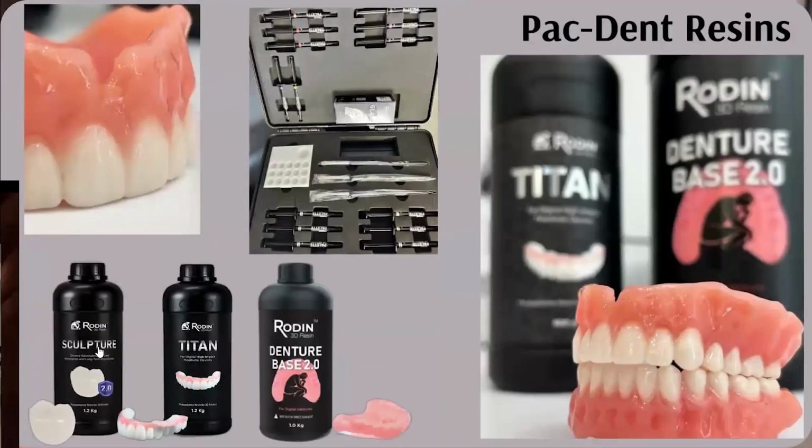Shoot, it's great. I've been watching denture bases all along, and up until recently, the Lucitone product was kind of a standalone thing as far as strength and aesthetics, but that's changing. And I told this several years ago that other people are going to catch up. And this denture here, this set you see here, I just printed recently out of their new denture base 2.0. And for the teeth, I used their Titan for this case, just to see how it would work for a denture tooth, more used for a fixed or maybe an implant case because it's so strong. But God, I'm thrilled. This stuff was pretty exciting. Looks good, feels good. I don't know exactly the fracture resistance compared to some of the others, but it feels to me every bit as strong as the Lucitone.